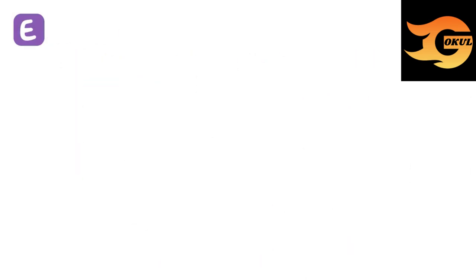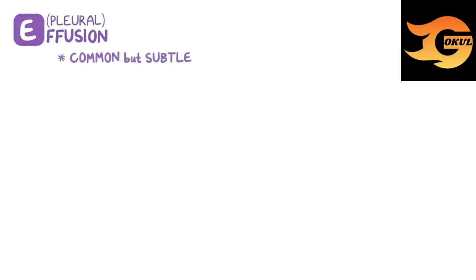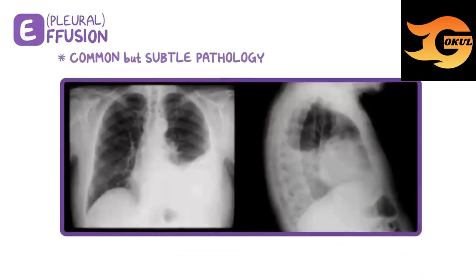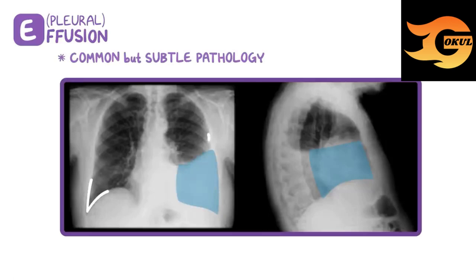E is also a reminder to check for a pleural effusion, which is a common but subtle form of pathology that you can see on an x-ray. Pleural effusions are fluid that collects at the costophrenic angle, and causes blunting of the normally sharp costophrenic angle.